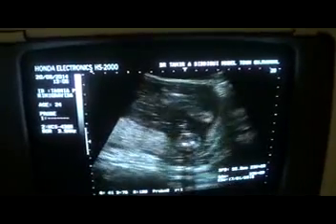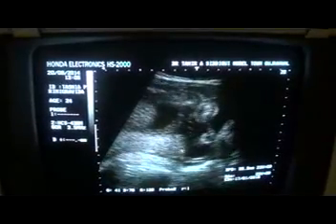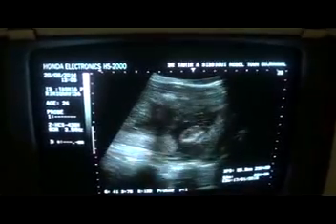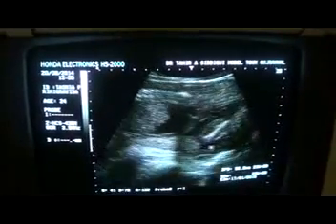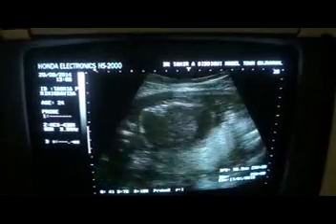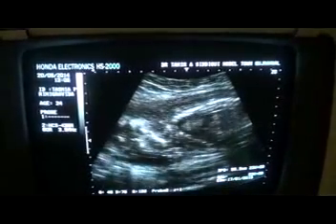Placenta posterior wall, and above the os. This is the placenta, and you can see it tapers off over here, whereas this cervix is far away. Here we are. This is the cervix, and here is the placenta. So posterior wall, placenta above os, and with ascites, fetal ascites, as well as pleural effusion.